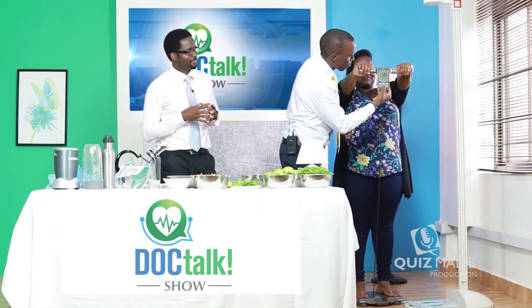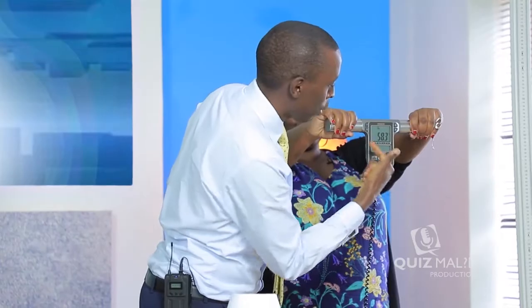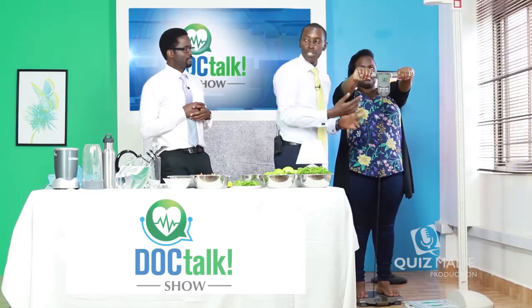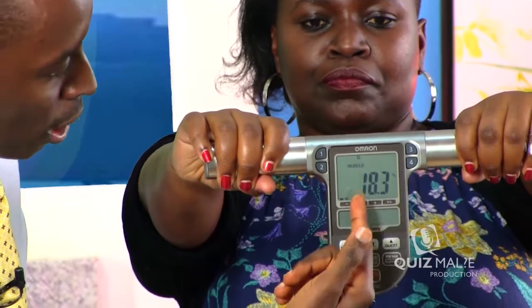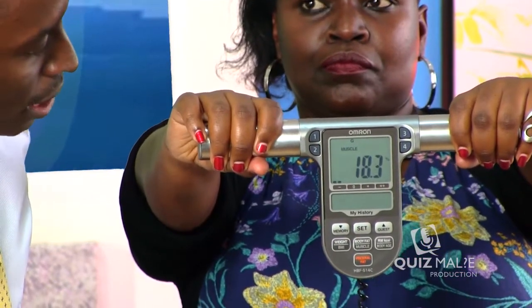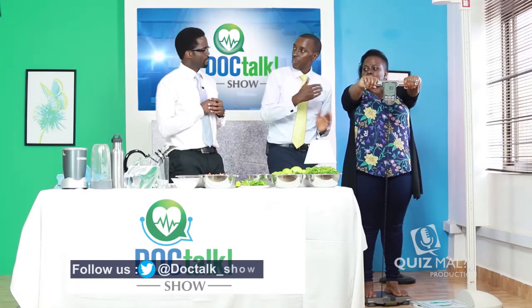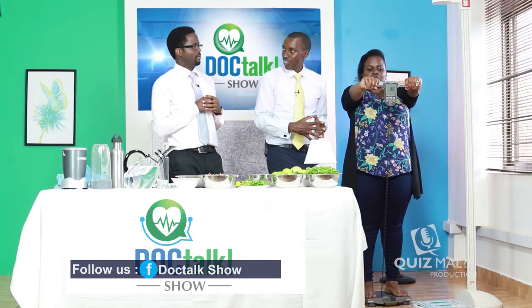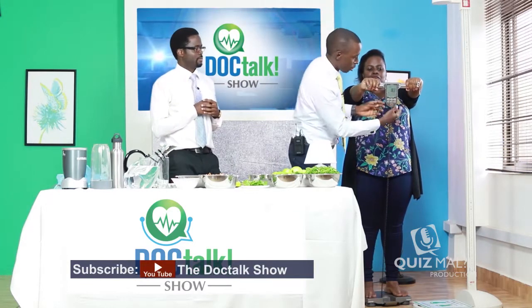So there's also the body fat percentage, which reads 58.3%. And for somebody in Mercy's age, the normal body fat percentage is between about 20 to 35%. And then we also have the muscle. The muscle percentage is 18.3%. And her percentage usually should be anywhere between 25 and 30%. So we want to get the fat percentage down and the muscle percentage up.